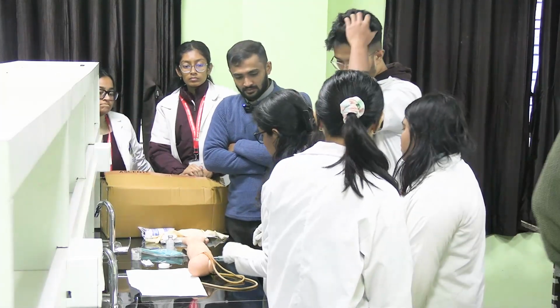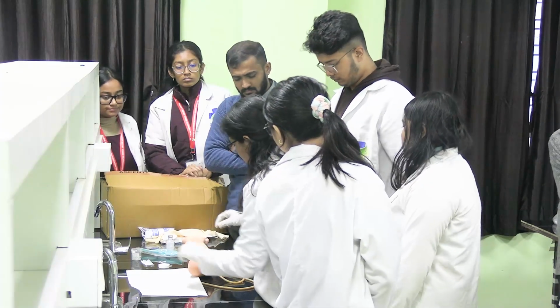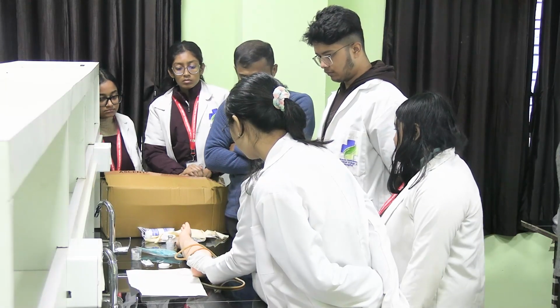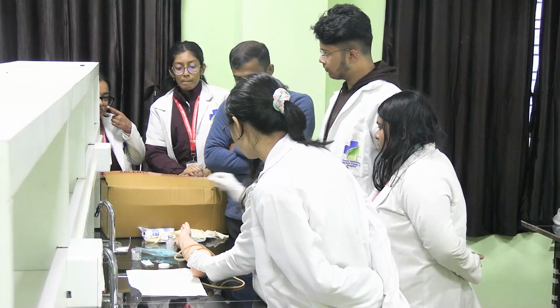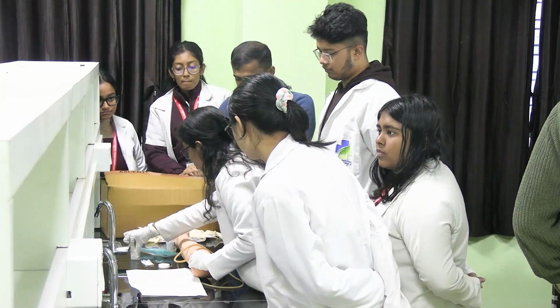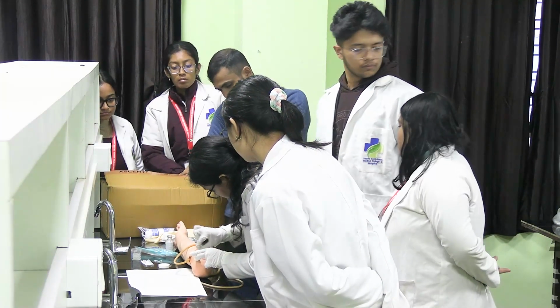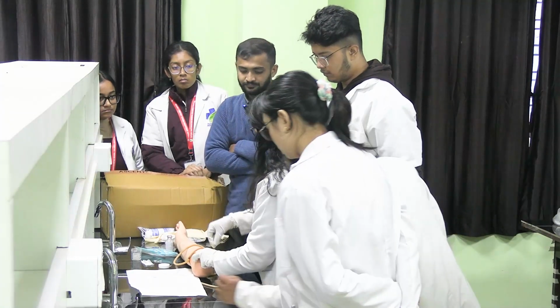Then I'll locate the area on the patient. It will be 2 fingers away from the acromion process. Then I'll sterilize that area. Disinfect that area using alcohol. I'll do this step 3 times.